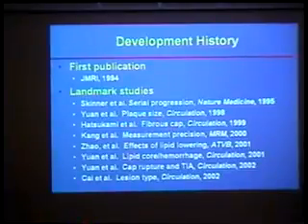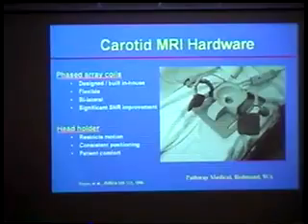specifically fibrous cap. And later on, we started to look at whether we can use MR to determine lesion types, as in the American Heart Association's lesion type definition. So as you can see, we are looking at different aspects based on a developed technique of using MR. What I would like to do next is talk a little bit about the technique that we're using.